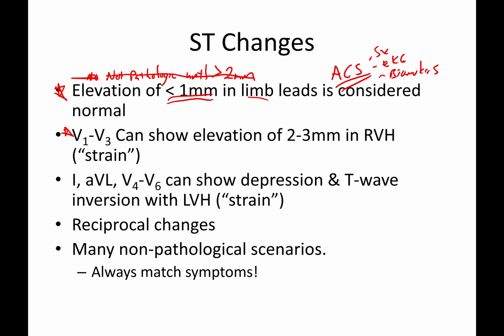All of it has to be done in their medical history too. Probably put that in there too, history. If you don't have all that, you may go down the wrong pathway. It's entirely possible that the patient may have the right kind of heart where they won't really make any kind of elevations or depressions, but everything else clicks, in which case it's not worth delaying. It's only 1 millimeter. That's not enough for me to say this is truly a heart attack, so I'm not going to treat them. You know what I mean? So just keep that in mind, that even a 1 millimeter elevation or depression is worth investigating and overlaying with their symptoms. Okay, that's that part.